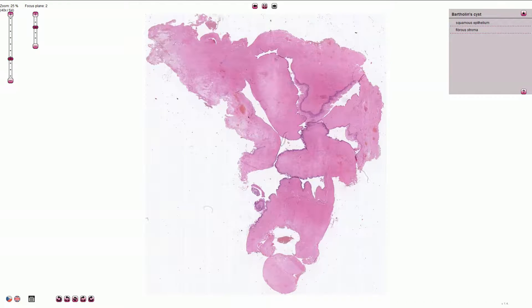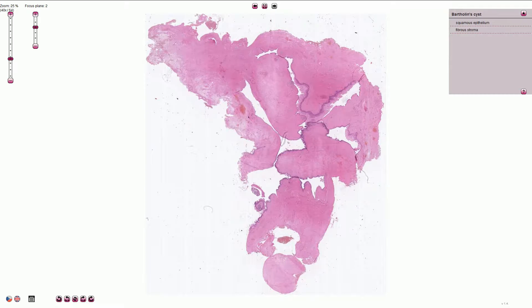Bartholin gland cyst is most commonly caused by the blockage of the duct of the Bartholin gland, and this obstruction is associated with retention of secretions and secondary cyst formation.